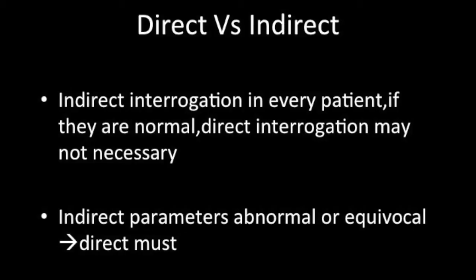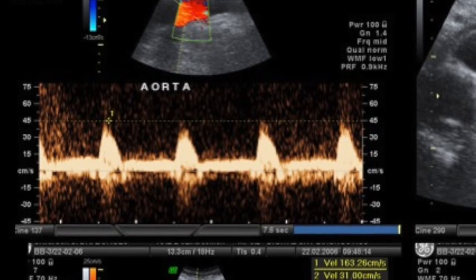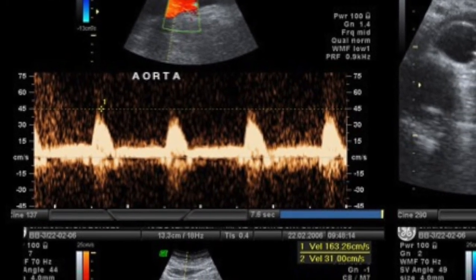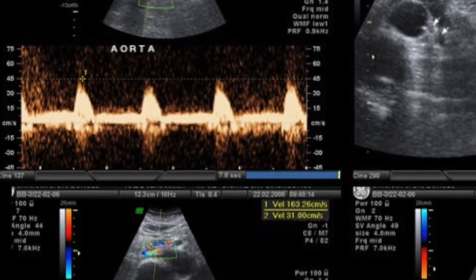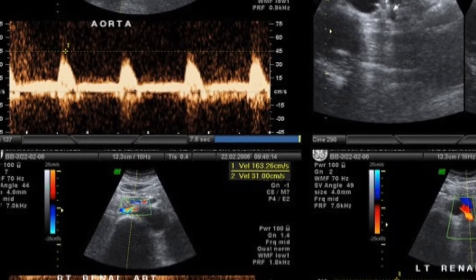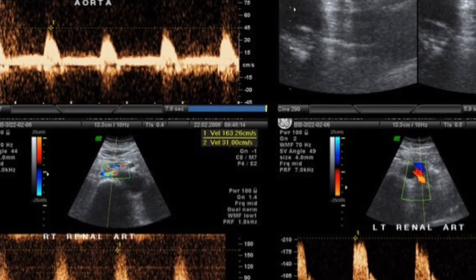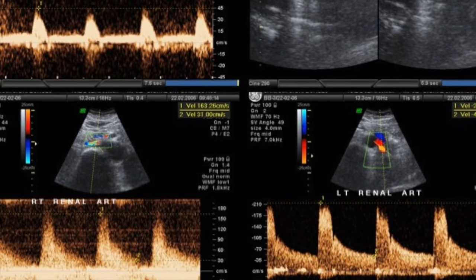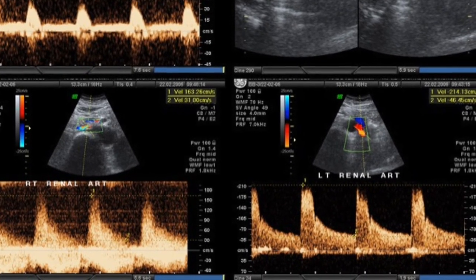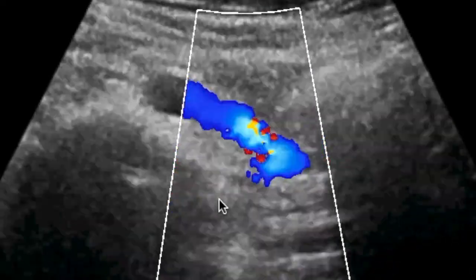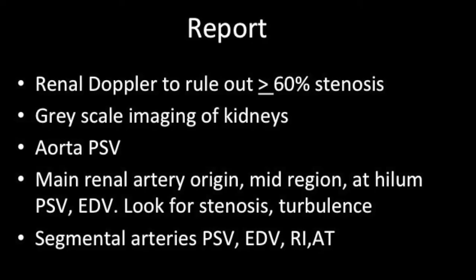Regarding the plus and minus points of direct versus indirect: indirect interrogation is a must in every patient. If they are normal, direct interrogation may not be necessary. If indirect parameters are abnormal or equivocal, one must look at direct parameters. In practice, always start by scanning the aorta, then do a transverse section from the epigastrium down, and try to visualize the main renal arteries in their entire extent. If indirect parameters are normal it may be acceptable even if the entire segment is not scanned, but if equivocal or abnormal, the renal artery must be interrogated in its entire extent.